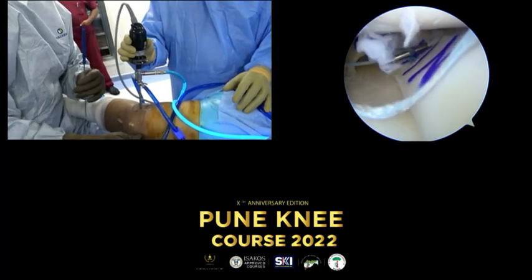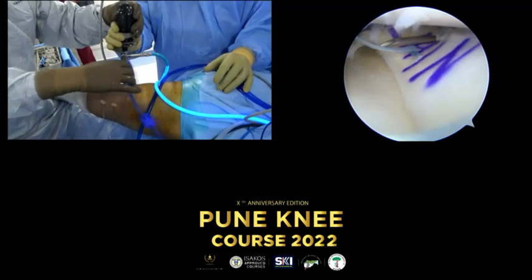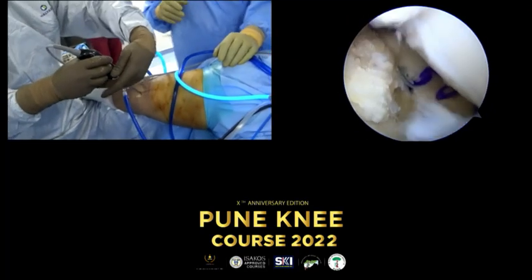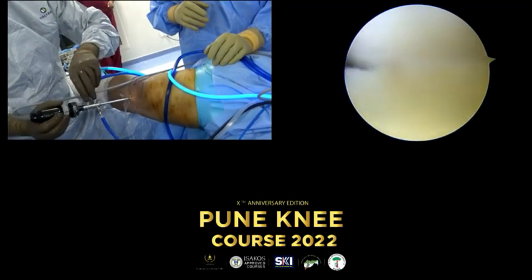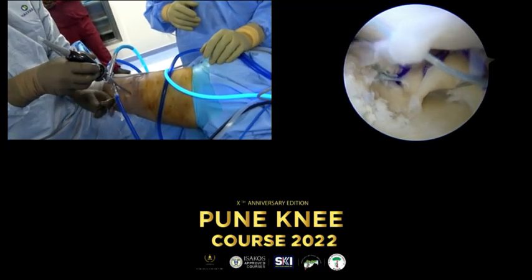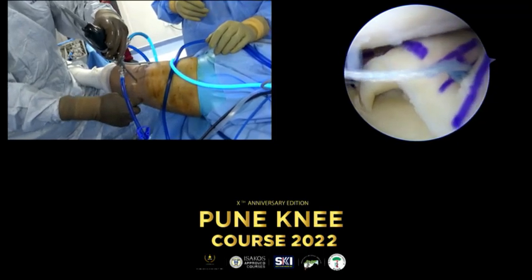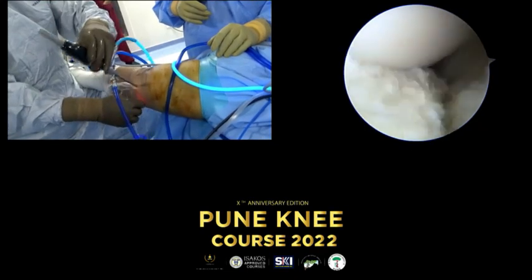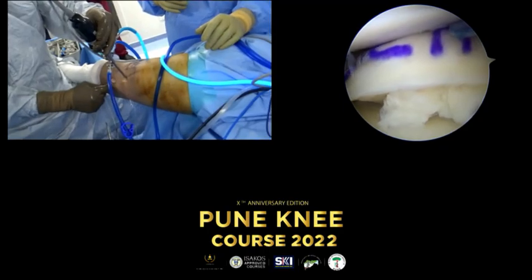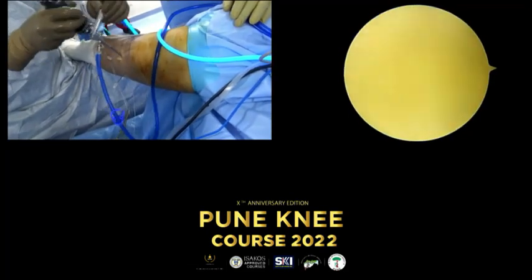Okay, now we can play. You see, I can hold it back. Can I help now? Now I like it better. We will switch now. I think that's an important trick. The needle keeps the graft down rather than migrate proximally. Yeah, but I don't like it because it's a little bit bent. Okay, probably I will go more anteriorly.